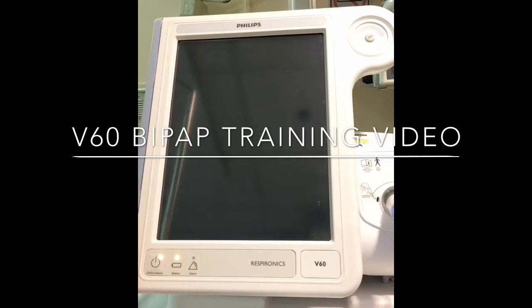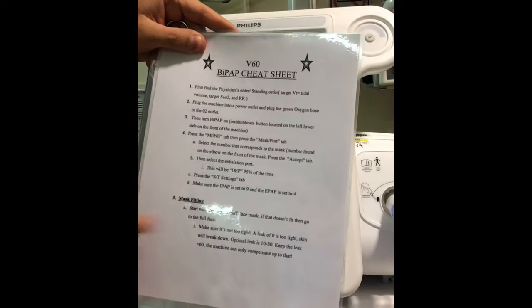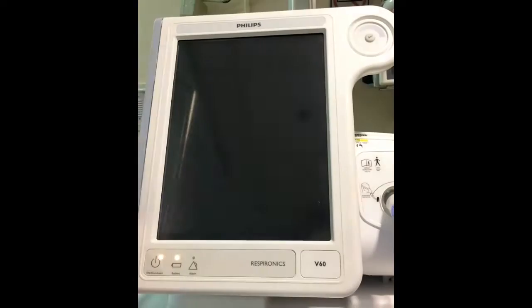Here is a video on the V60 BiPAP. It's your training video. I'm going to be following off the BiPAP V60 cheat sheet. So I'm going to try and go through all of your steps on here and walk you through it, just in case you have any problems setting it up.